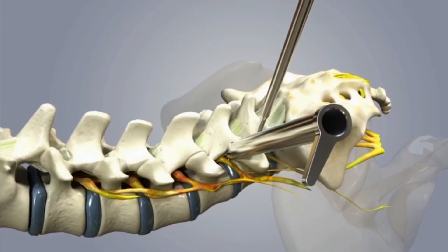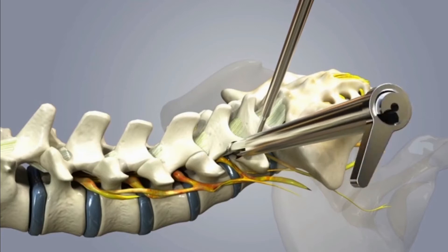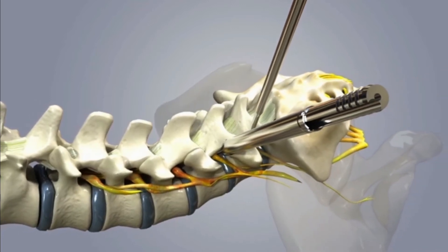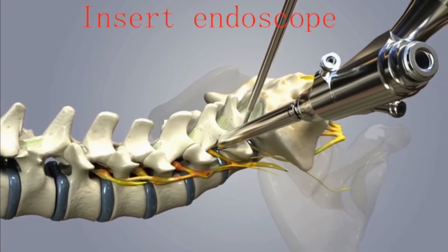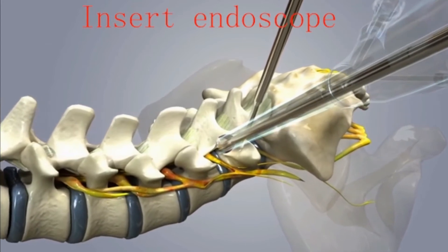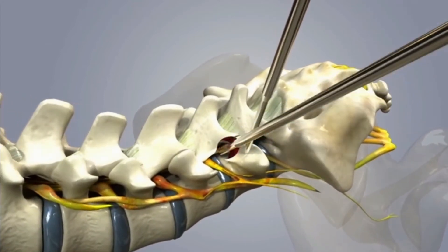With the guidance of a guide rod, the working channel was placed through Kambin's triangle. Then the endoscope was connected and the working channel was moved right to the intervertebral disc. The working cannula was rotated to keep the exiting nerve root in a safe position, under endoscope monitoring.